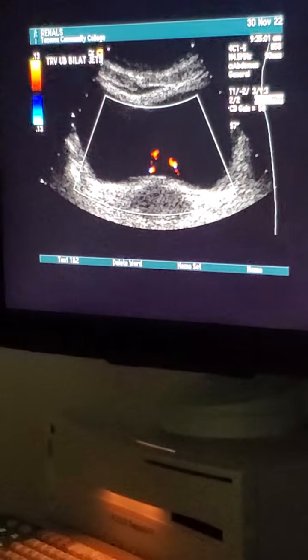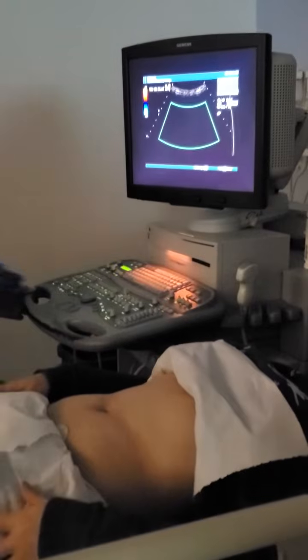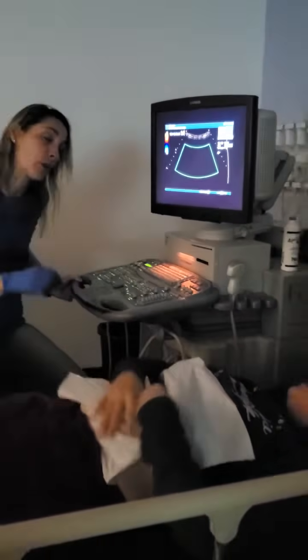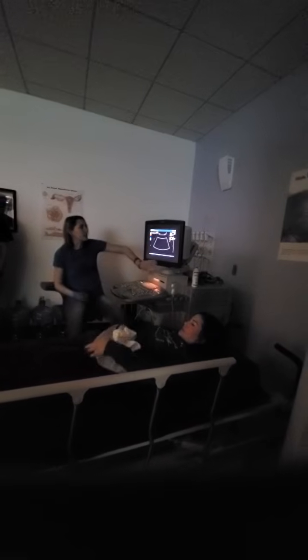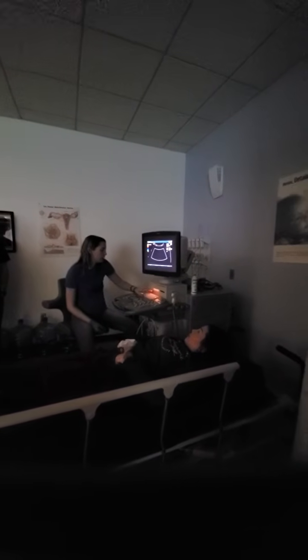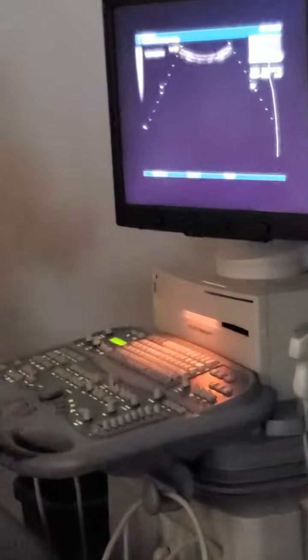So then we're going to have our patient use the restroom. I'm going to lower you down. Please go ahead and use the restroom. Your bladder is very full, so I want you to go twice until you're totally empty. You got it. And then for annotation for this, we're just going to go Sag, UB, post void, which is PV. And then we'll wait for our patient to return, which is the longest waiting in the world.